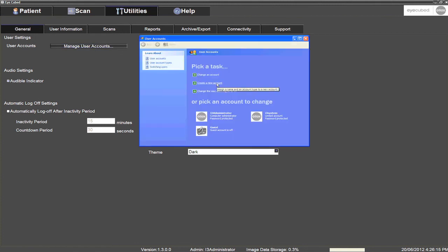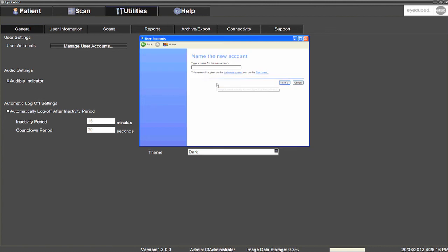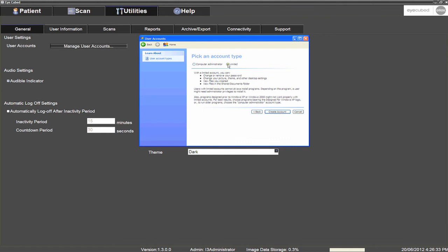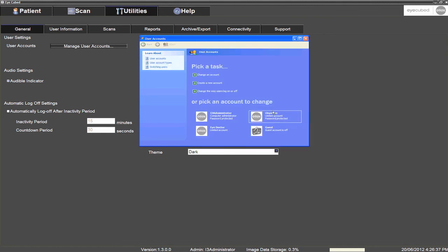In general, the name of the user will be entered in the Name of the New Account field. Once you have entered the name for the new account, click Next. Ensure Limited is selected and click Create Account. Your new user account has now been created.